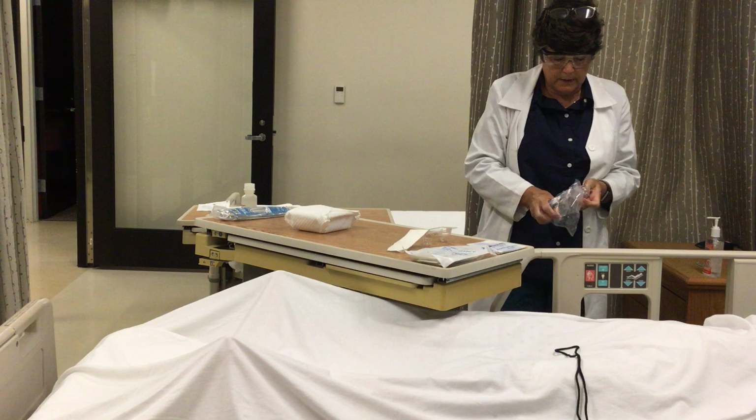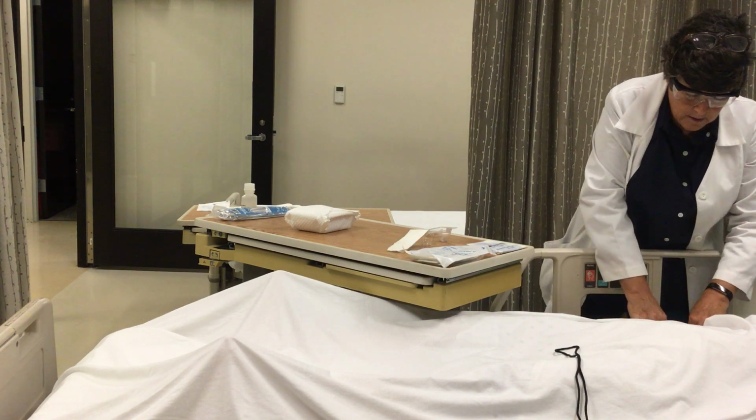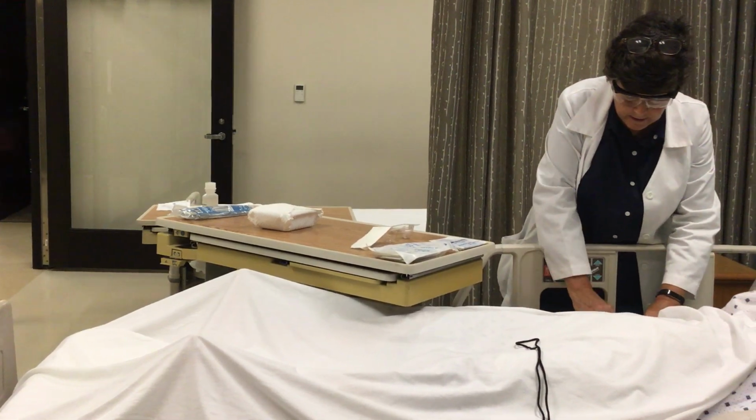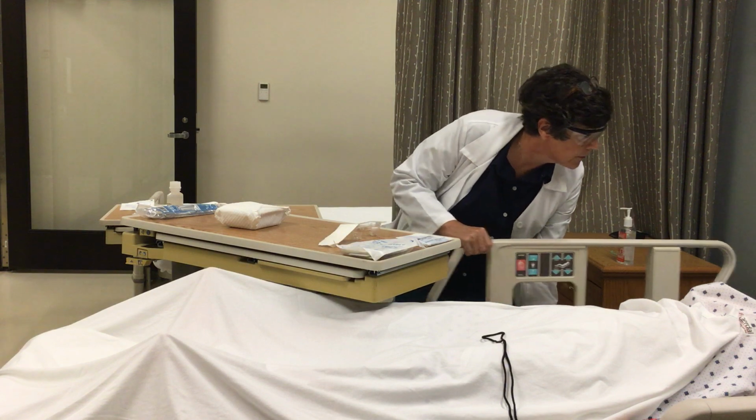I'm just going to open this up in case I might need it as a garbage bag. It's not very big, but I have it here just in case. Oops, Ms. Cruiser, I'm going to put your side rail down also.